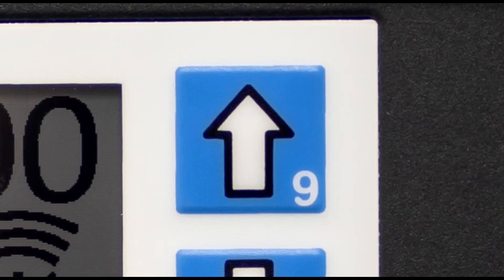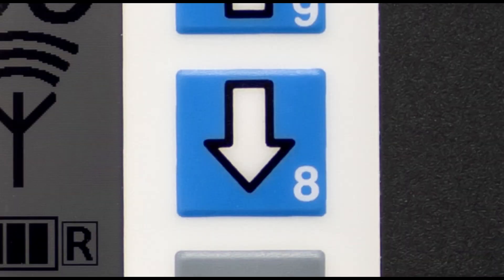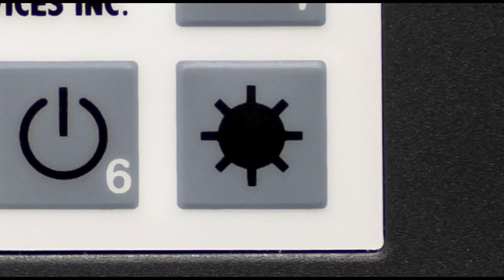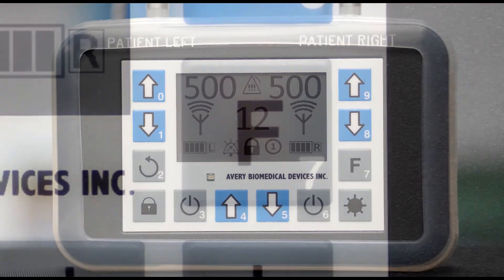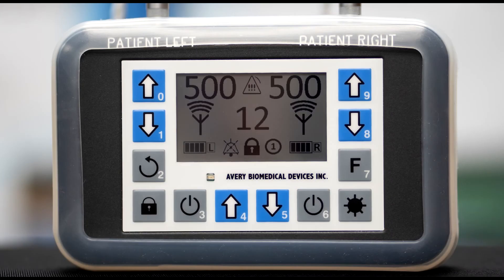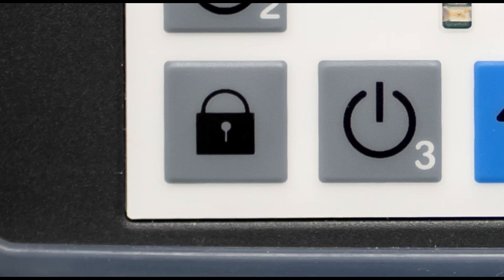Key 9 increases the right side amplitude. Key 8 decreases the right side amplitude. The backlight key activates the LCD backlight. Key 7 temporarily mutes the alarms. Keys 0 through 7 will have no effect unless the keypad is unlocked by pressing and holding the lock key for a minimum of 3 seconds.